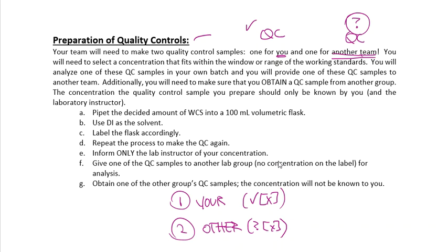Never share that concentration with another group. The only thing that we want you to do is tell us what that concentration is going to be. That way we can make sure that we write it down, and if you're not there that day, or if your lab group has left early and the other lab group's still there when they want to know how well they did, we have something to go by. We don't have to call you up, and you don't have to give us that concentration again.